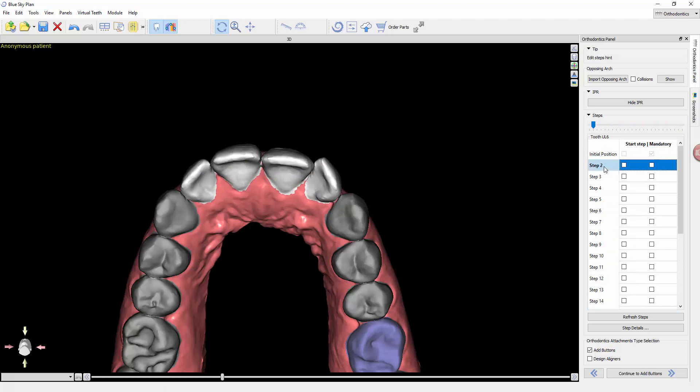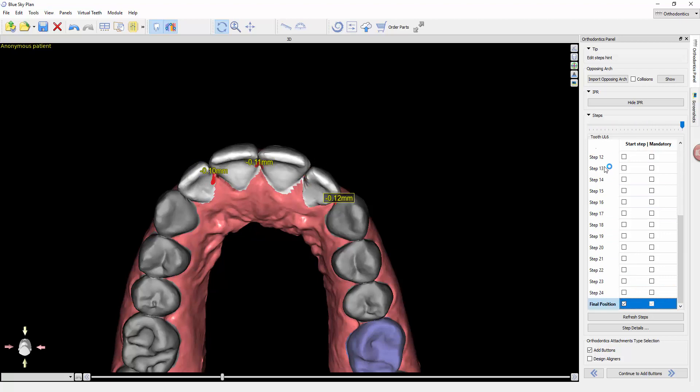Step 2 would be the first actual aligner, and we progress all the way through to the final position. This would be a set of 24 aligners to accomplish these movements with bi-weekly wear.